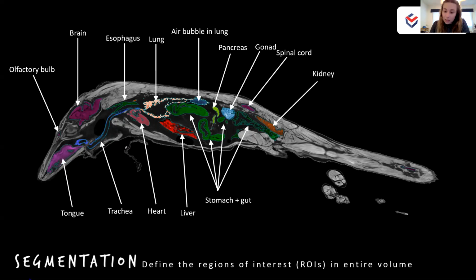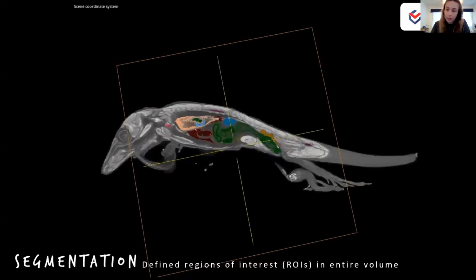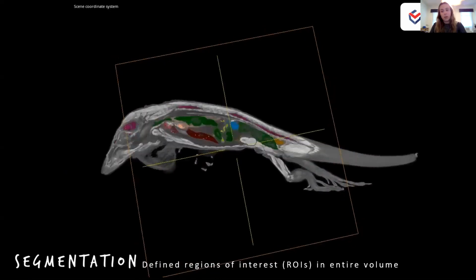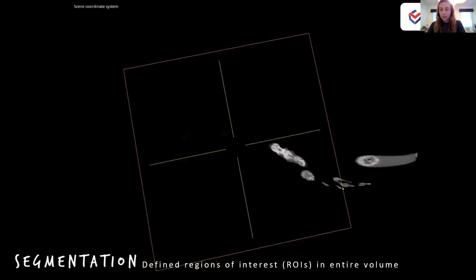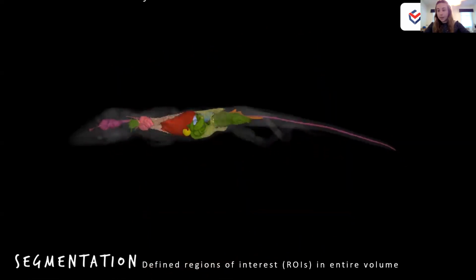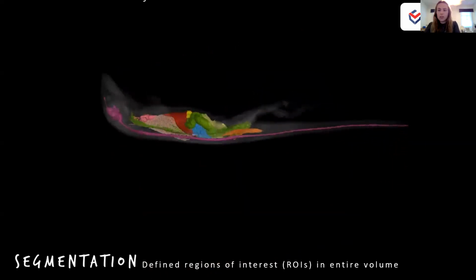So if we manage to do what we've done here in all of the 848 slices that make up this particular CT scan, we end up with something that looks like this. We have defined our regions of interest and we are able to visualize them in 3 dimensions. So here I'm slicing through them in that same sagittal plane. And here I have made the rest of the body transparent so that you can see the organs in 3 dimensions.